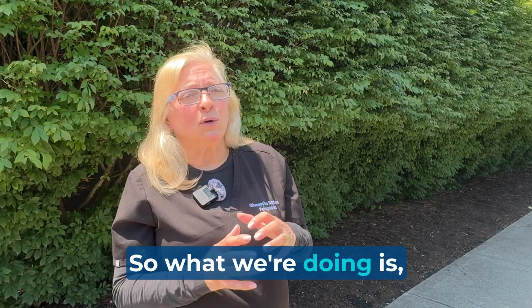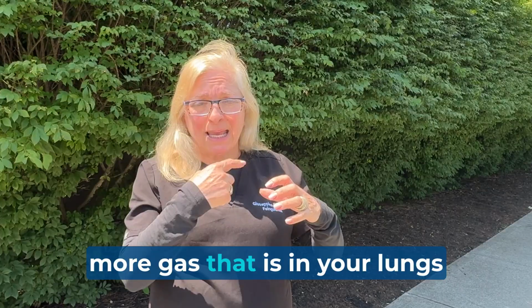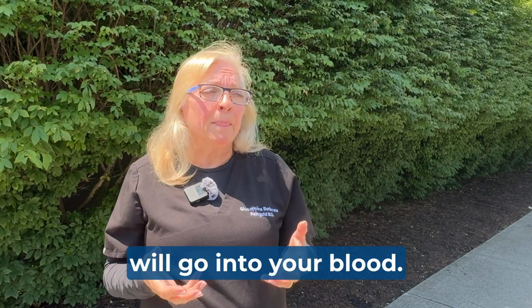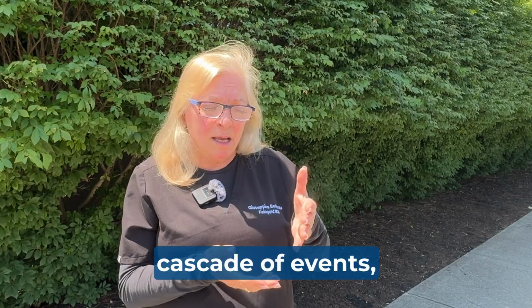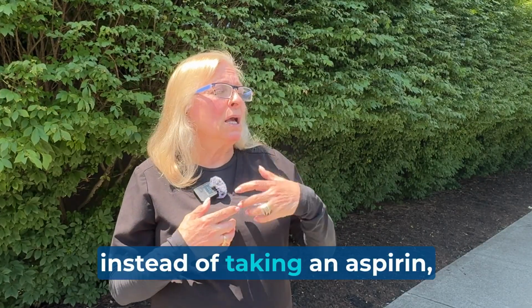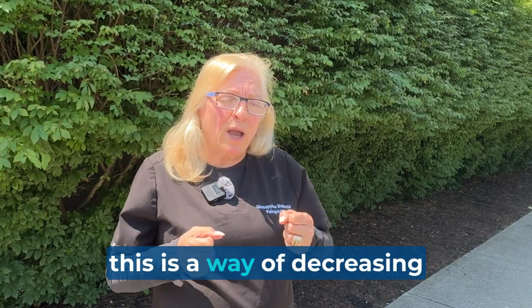So what we're doing, when we're going into a hyperbaric chamber, is increasing the pressure, and therefore more gas that is in your lungs will go into your blood. That will trigger a whole cascade of events, including anti-inflammation. So instead of taking an aspirin, a Tylenol, or an ibuprofen, this is a way of decreasing inflammation.